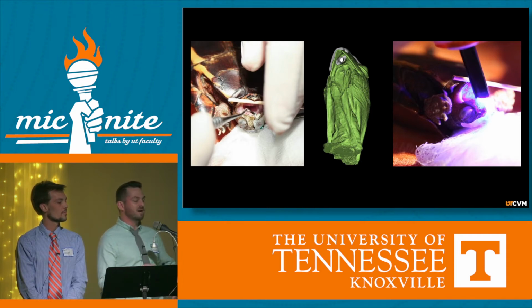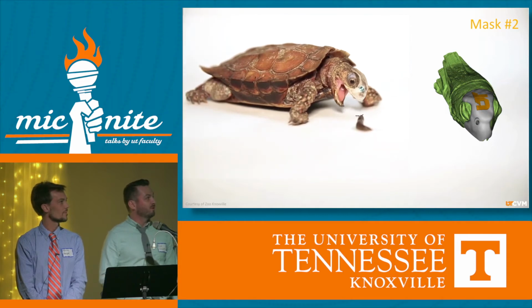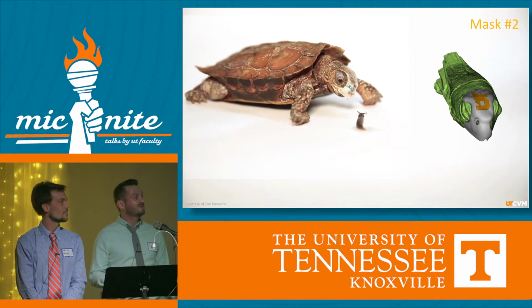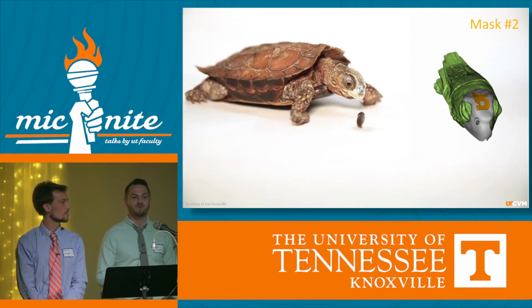That's a light that just shines at a certain wavelength. And we're done when this hole is completely filled. And hopefully the mask stays on the outside, the tooth kind of keeps it on the inside, and it brackets things together. So back at the zoo, we can see Patches with her little fancy nose ring. And while it may take her a few tries, she does get her little meal, and she's been doing well at the Knoxville Zoo since this time.